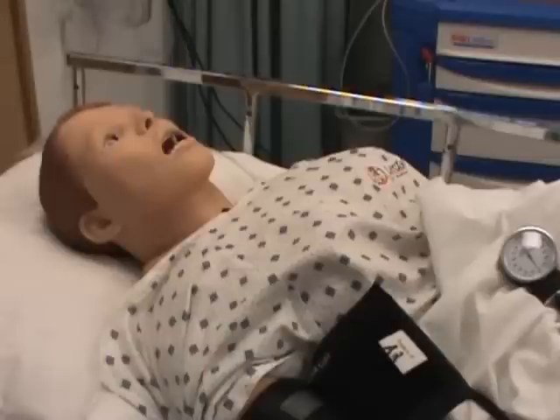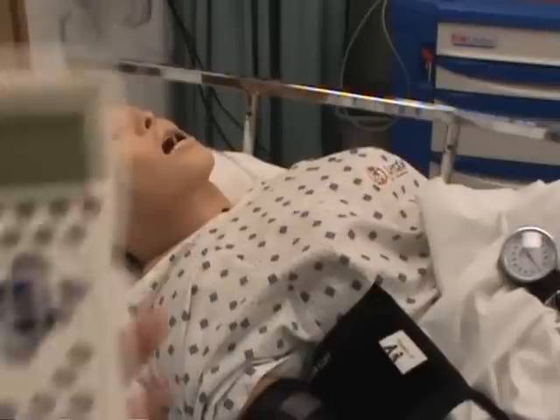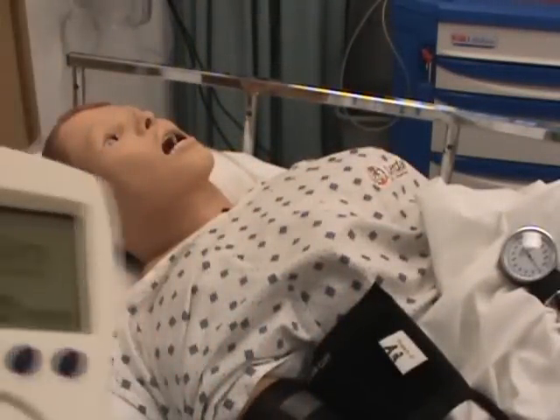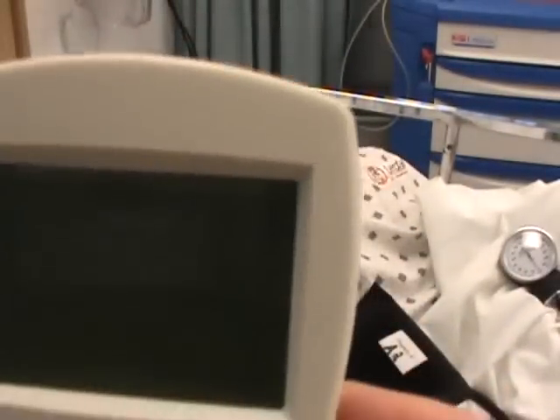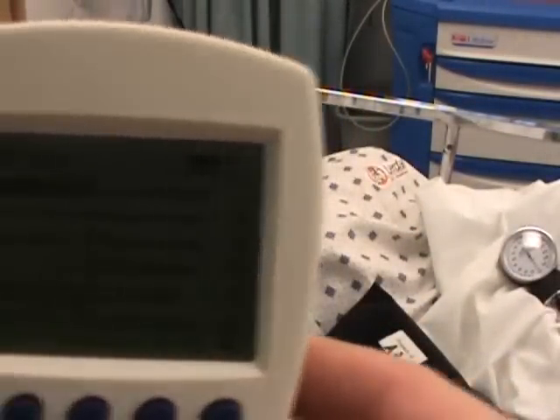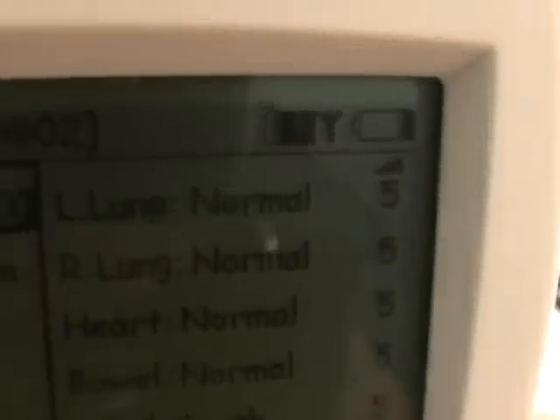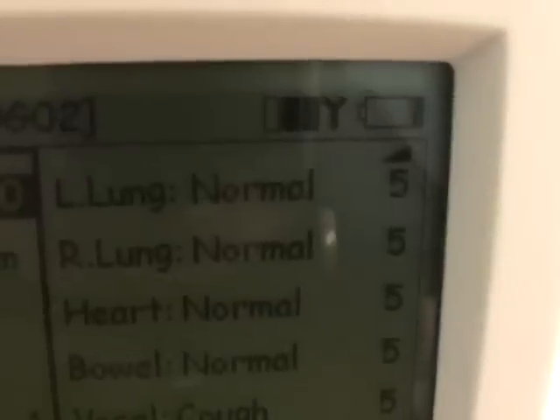Let's talk about default settings with the vital sims. Once you've turned your power box on and you've turned on your handheld device, you'll notice a standardized set of baseline vitals that the sims starts on. You will see here a heart rate or sinus of 80, a blood pressure of 120 over 80, and normal lung sounds with a volume of 5.